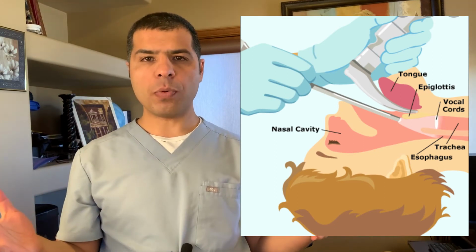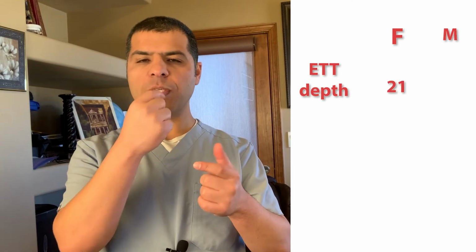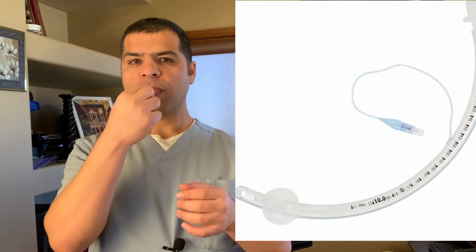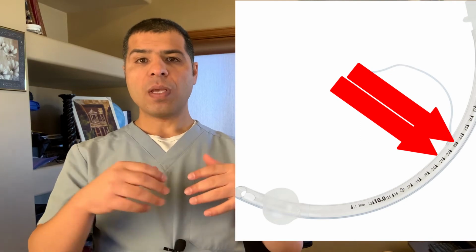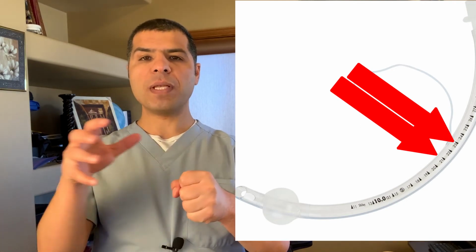Now, what's the appropriate depth? I usually measure that at the central incisor. In females, I usually try to stop at 21 centimeters, and in males at 23 centimeters. That's why you see these numbers on the ET tube. So at the central incisor, remember 21 centimeters in females, 23 in males. And then at that point, I tell RT immediately to connect the CO2 detector.